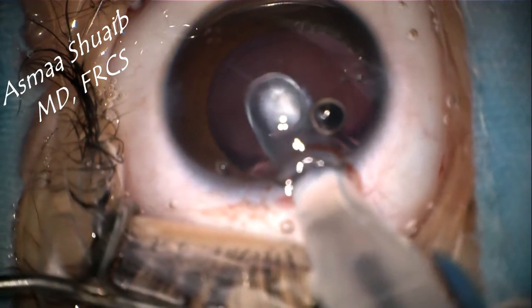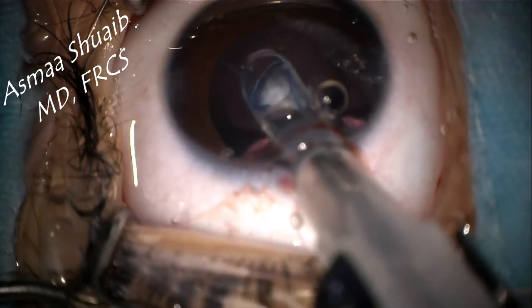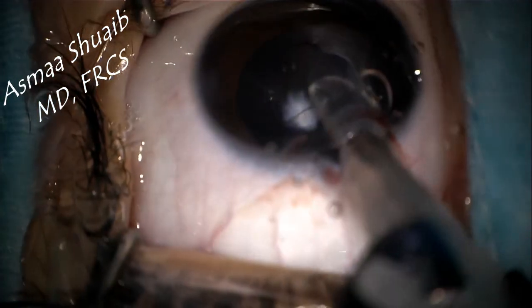Then insert the trailing haptic into the posterior chamber. This is another example of the movement while implanting the leading haptic and the optic. Notice the rotation to the right and then the rotation to the left.